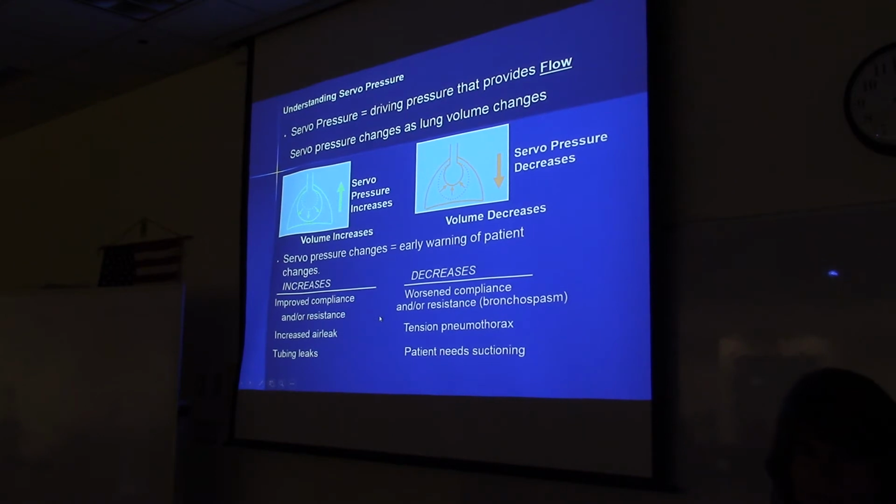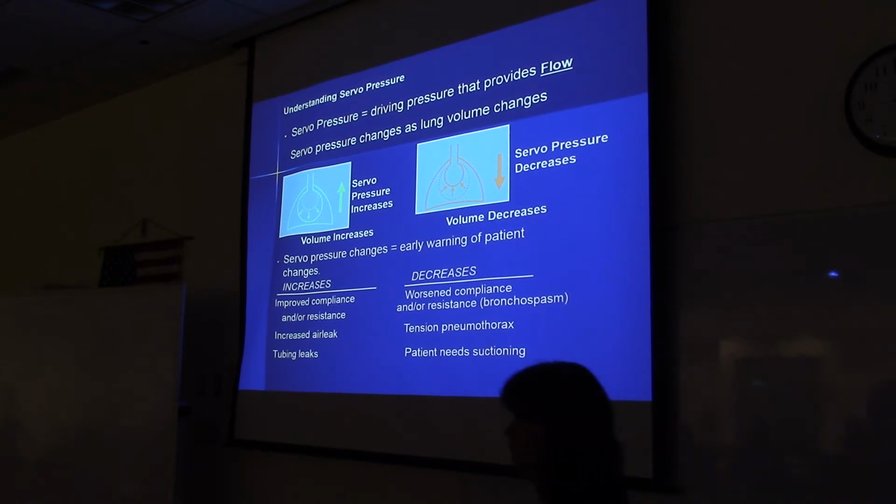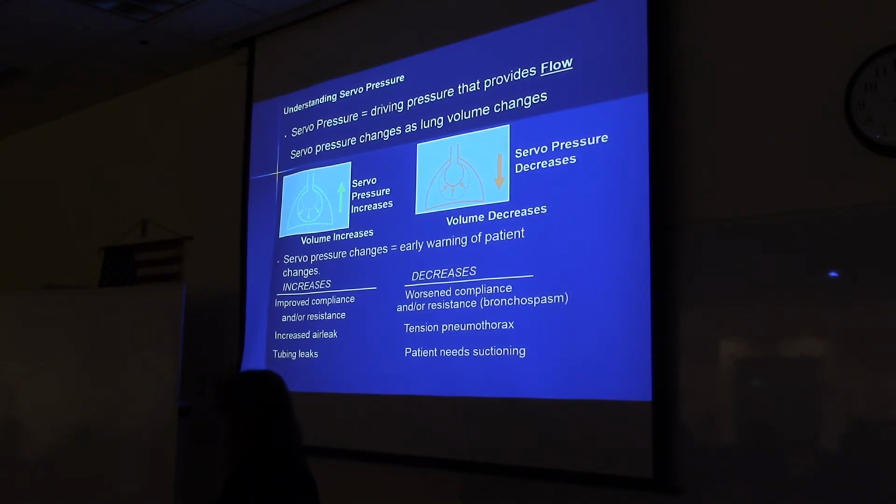And there's a slide on servo pressure. We'll go to the website in a minute. What I want to do is explain servo pressure to you, and then we'll read that slide.